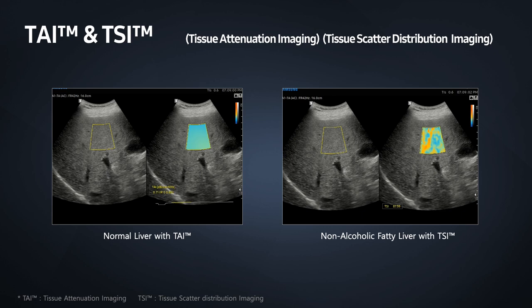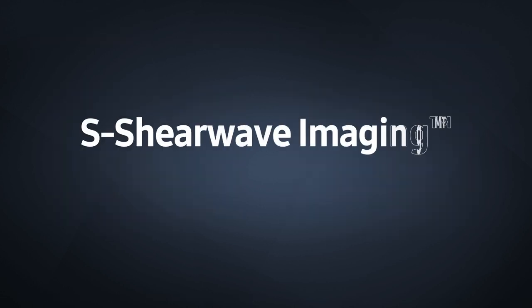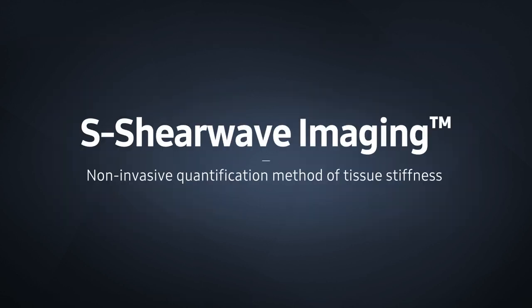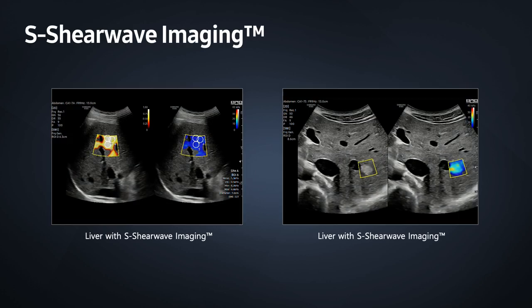Tissue scatter distribution imaging (TSI) provides a quantitative measurement of tissue scatter distribution to assess fatty liver changes. The distribution of scatter changes in relation to the degree of fat within the liver. S-shear wave imaging provides noninvasive quantitative assessment of tissue stiffness for more confident evaluation of liver parenchyma. The color-coded S-shear wave elastogram provides more confident placement of ROI cursors.